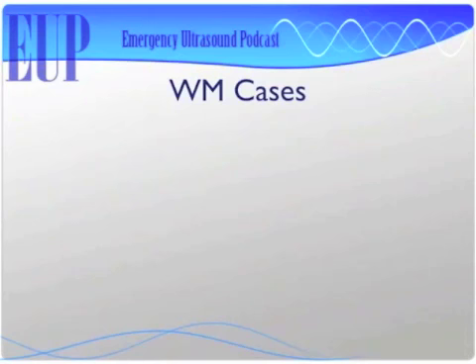This is pretty exciting that I've got another tool that I can walk in quickly on the patient that I'm really worried about and take a look, and in a matter of 1 or 2 minutes see if there is a wall motion abnormality. You told me that 80 to 90% of these patients that have real disease will have a wall motion abnormality. This is pretty cool that I could get those patients to the cath lab quicker. Yeah, all you got to do is use it.